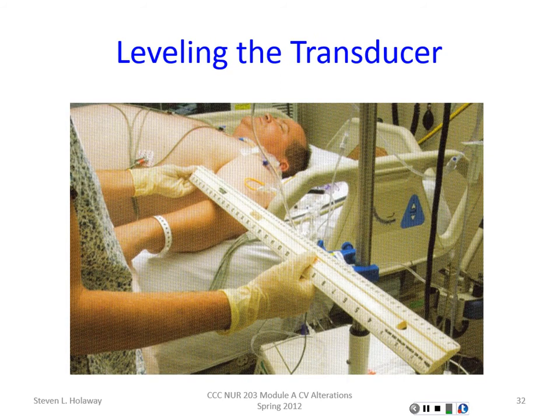And this kind of shows, and I forgot to bring down my homemade one that I've used before. It's nothing more than a yardstick with a string level on it. That's all it really is. They've got these fancy ones. That's what I used at Walter Reed, big fancy Army hospital. We used a yardstick with a string level. Works great. But now they've got these nice fancy ones that you can clean real easily. So, you know, it does make more sense that you can clean it for all the bacteria and everything that's there. But that's what that nurse is doing.